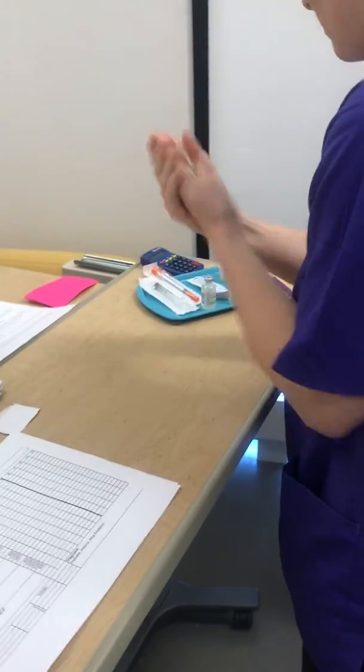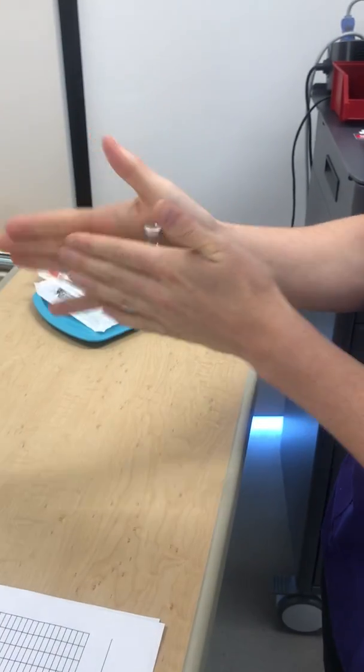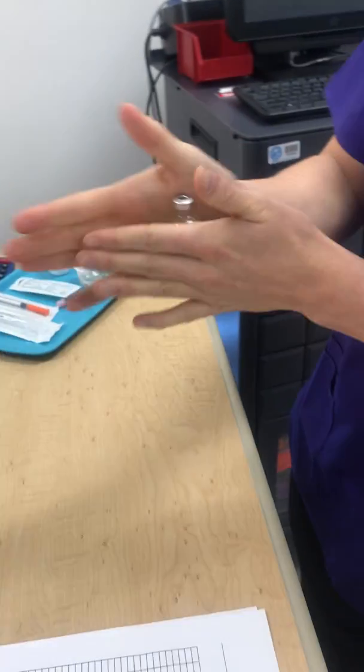Okay, so now I'm going to wash my hands first. Okay, and I'm going to roll my NPH about 10 to 20 times. 10, 11, 12, 13, 15, 16, 17, 18, 19, 20.